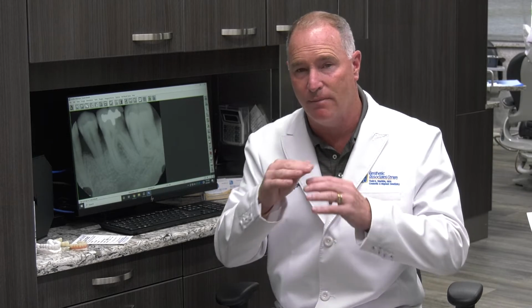You can grind them, you can adjust the bite. If you adjust the bite significantly, take a new confirmation bite with that try-in in place. And that's not a bad idea to do anyways. Okay, but go ahead and make those changes and make a note of what you changed.